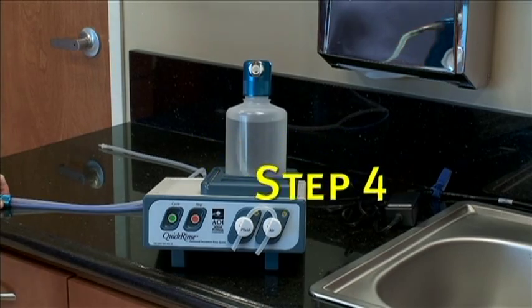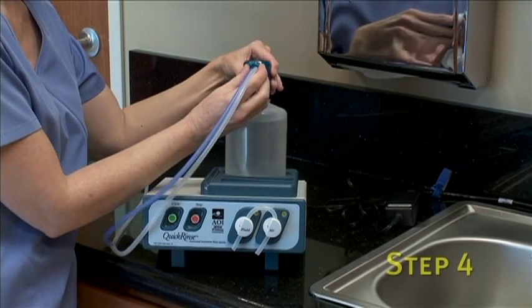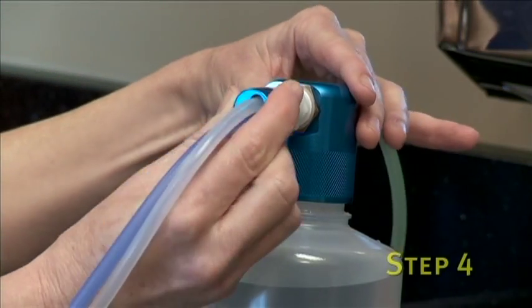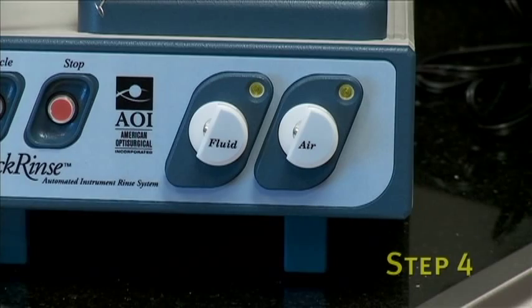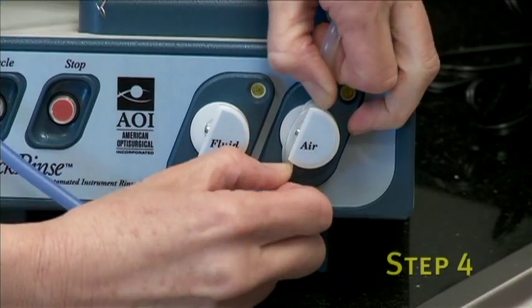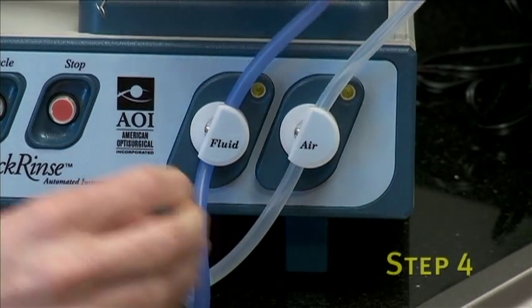Step 4: Take the dual lumen air and fluid tubing provided with your unit and connect it to the white female plastic fitting on the fluid container cap. Again, make sure you hear a click to ensure the connection is secure. Now look to the front of the unit where you will see a fluid and an air valve. Take the clear line and insert it into the air valve, and insert the blue tubing line into the fluid pinch valve.